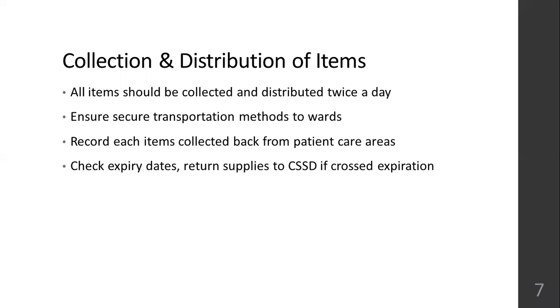Check expiry dates, and return supplies to CSSD if they have crossed expiration. Record each item collected back, as mentioned. Expiry dates should be checked.